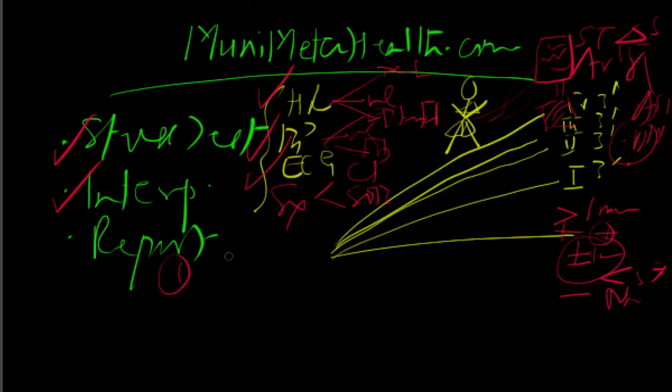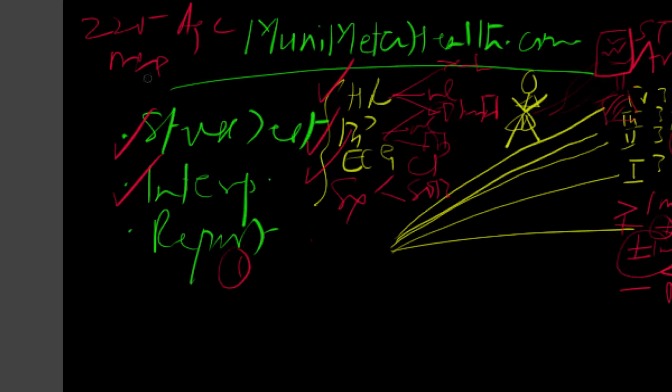Well, number one, you'll say whether the patient exercised to the ability of an average age. Now, say for instance, the magic number here is, remember, 220 minus the age. That'll be your maximum heart rate. It's very important to understand that.